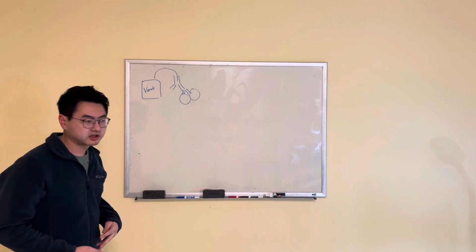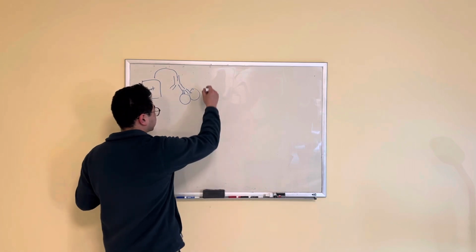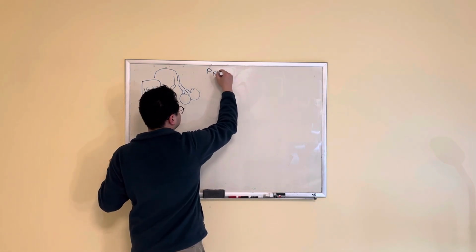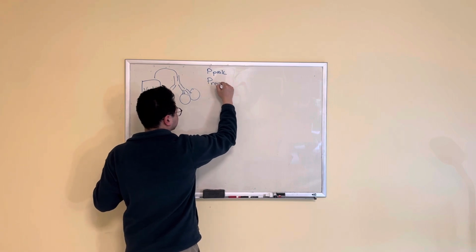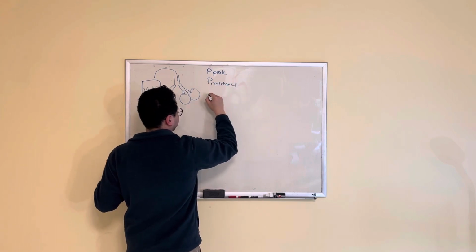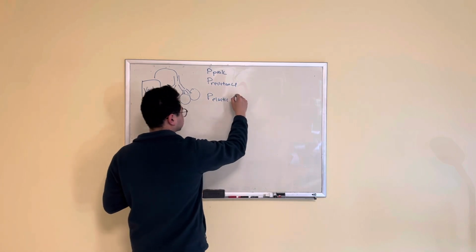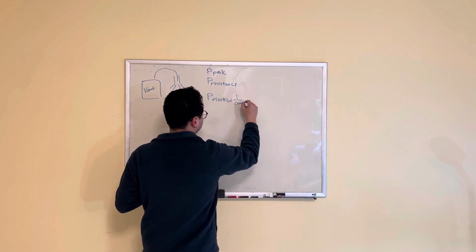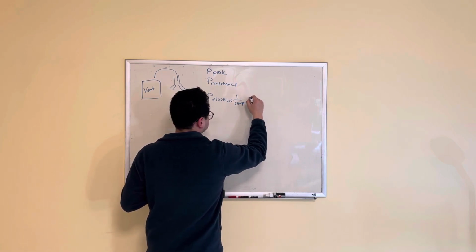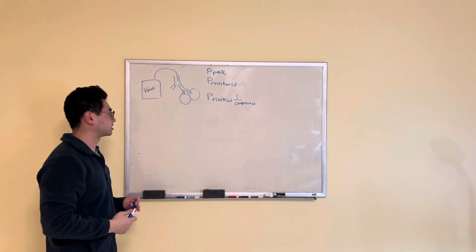As I said, the total pressure, which is the peak, is going to be a sum of the other pressures, your resistance and your elastic pressure. This elastic pressure is proportional to 1 over the compliance, and we'll define it as the plateau pressure momentarily.